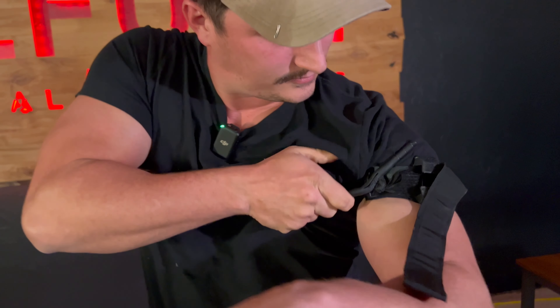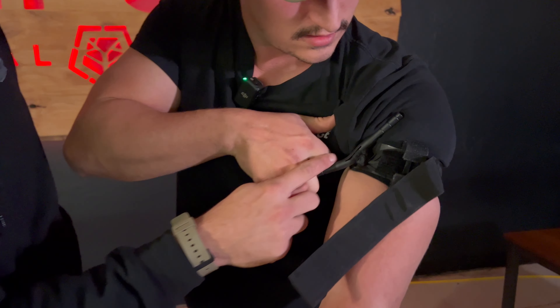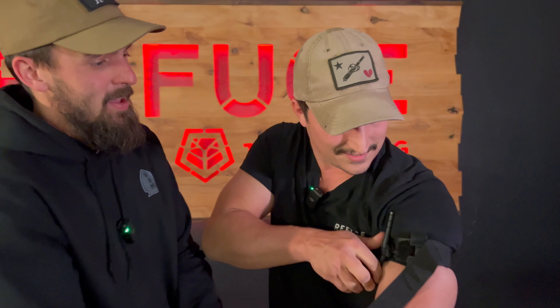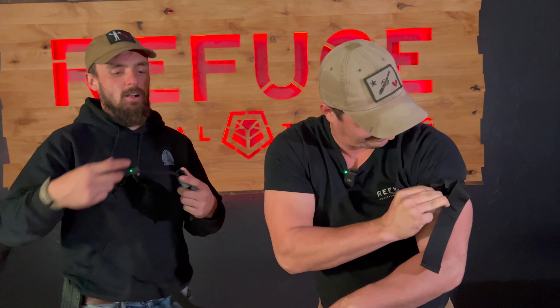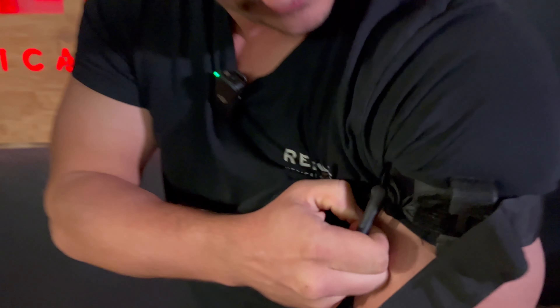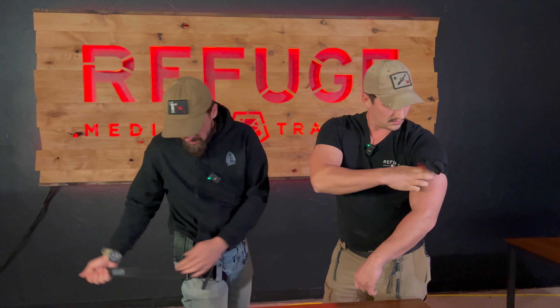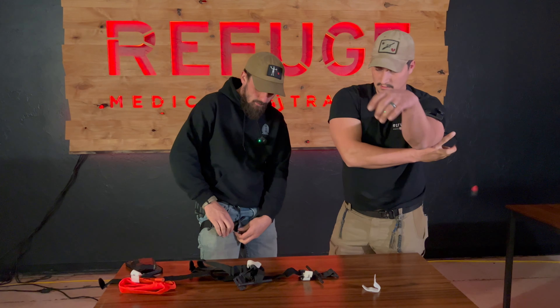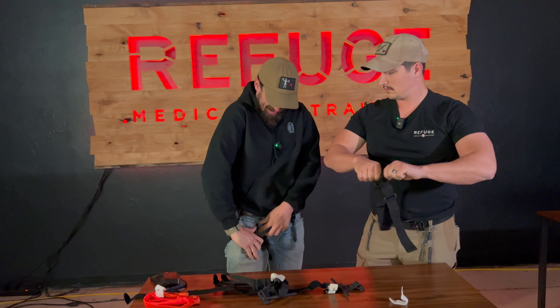This band right here just shreds. This one's a little thicker — it seems like they've got two layers, which is an improvement over the old single layer that would just shred while putting it on. He's struggling to get it, and see what it's doing — it should not be making that S-curve. That's seven turns, with a full S-curve in the windlass. He's on the seventh turn and still has a slight pulse — he needs more — and the windlass is just failing.